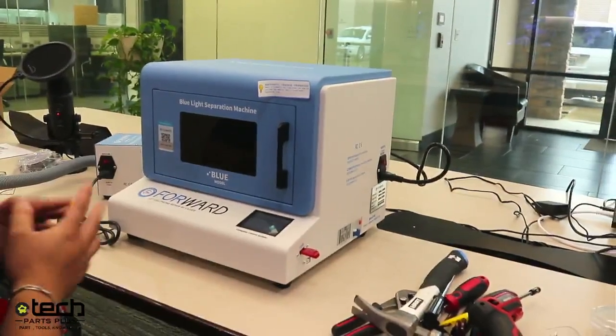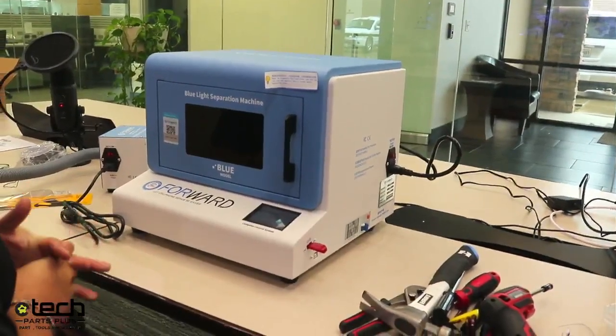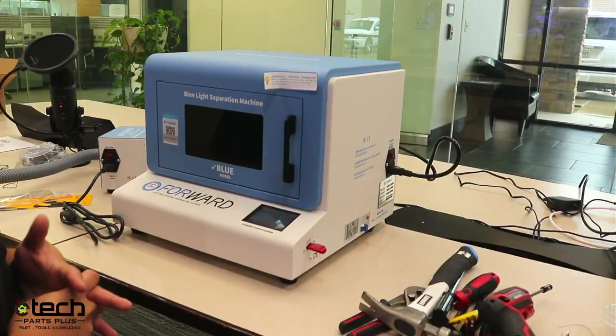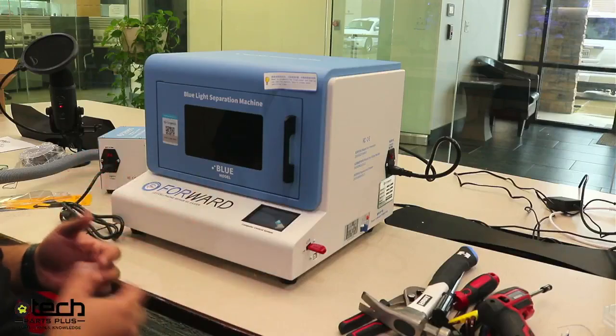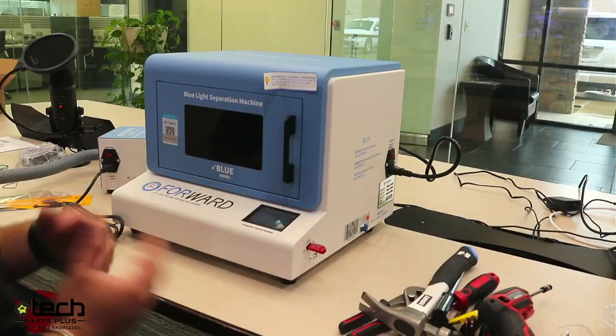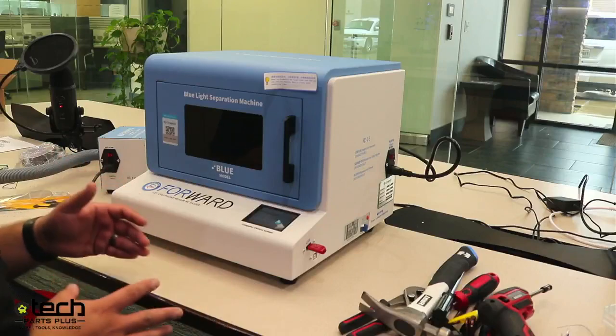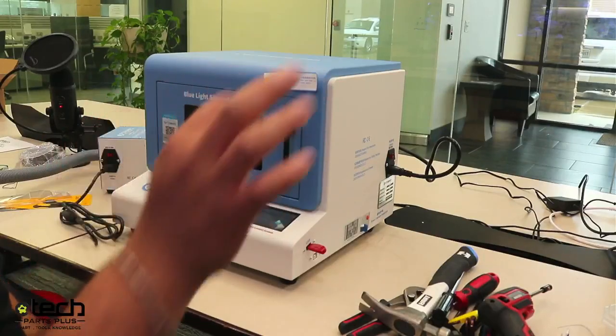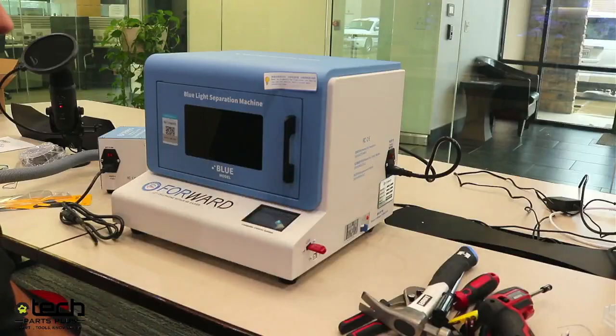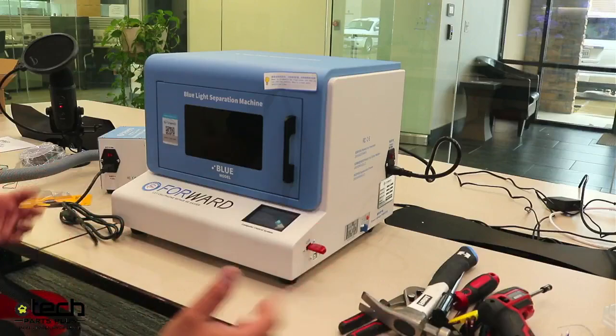If you get a machine that only has up to iPhone 12, you'll have to update it. When the 14s come out, we'll put an update on the blue laser support page. You go through that process to update the flash drive and you're ready to go.